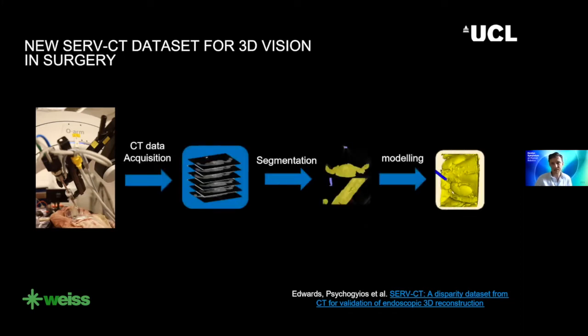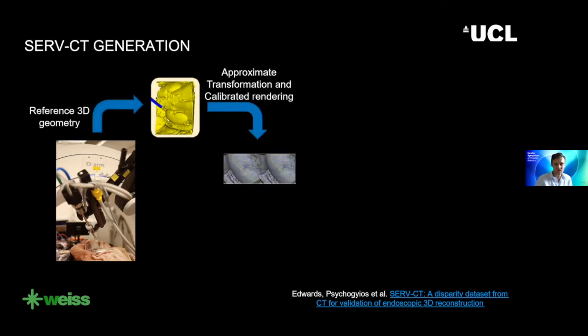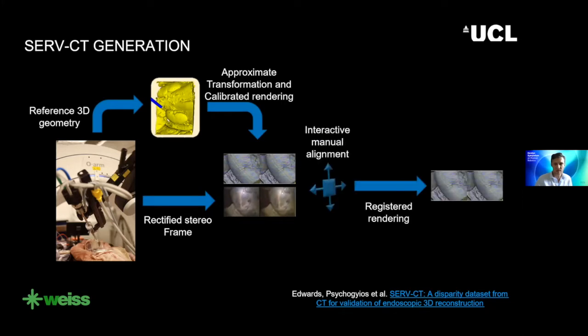So this is, I guess, closer to what would happen in a clinical system, because the patient would get the 3D anatomy generated from tomographic imaging, and we try to align this information to the video images that we acquire of the cadaver anatomy, and then we manually try to refine this alignment. And you might ask, why do we manually try to align it when you can insert fiducials and so on? I think the answer is that it's really tricky to get the fiducial systems to work.